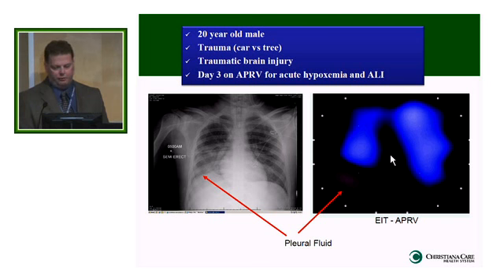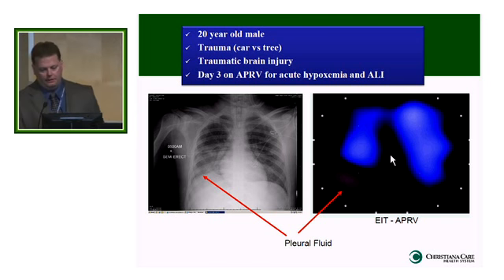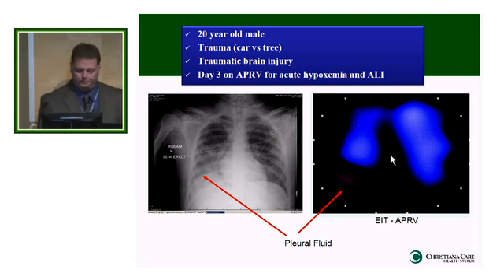This patient had a pleural effusion and atelectasis here, and you can see that's an area where if we took a CAT scan, this person would not have lung opened up in that area, and they are de-recruited in that area. The other thing I think is interesting when you talk about that dwell time and the convective forces, this showed me how well in APRV the heart is mixing that gas around. The heart is mixing the gas and making each breath so much more efficient in APRV with that long dwell time.